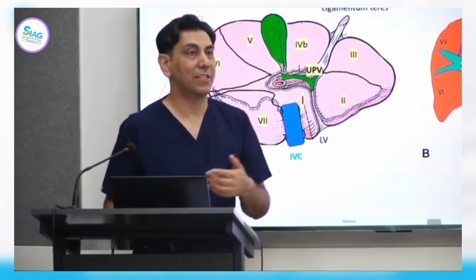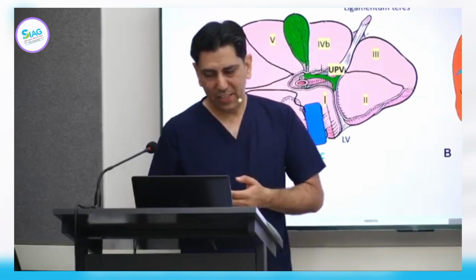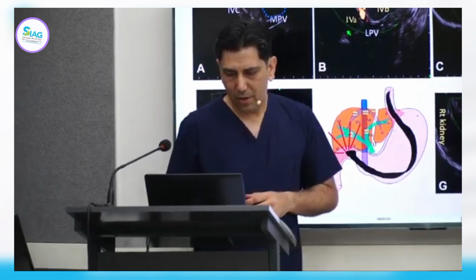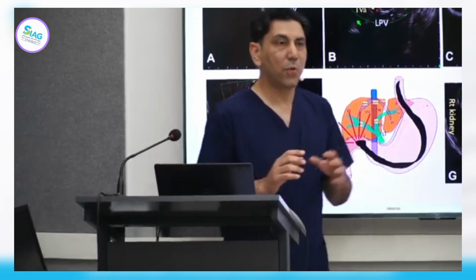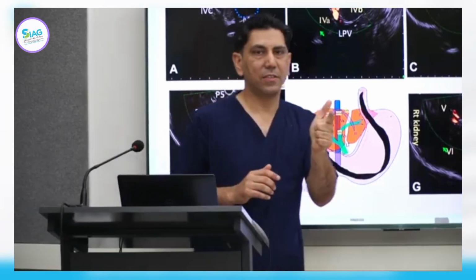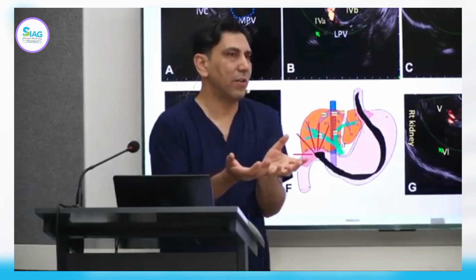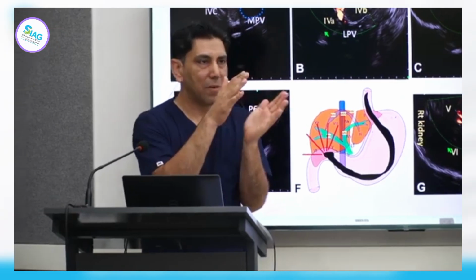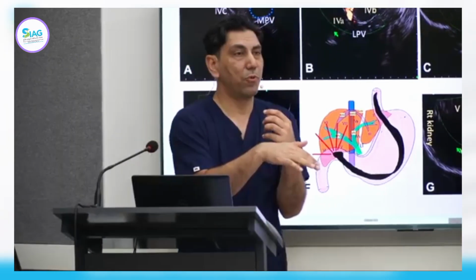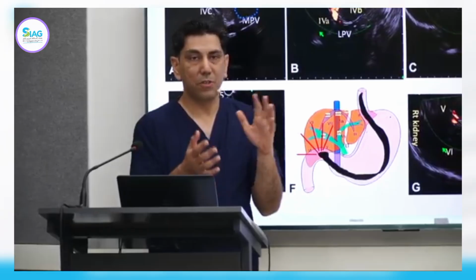This is again similar to the examination of D2 when you're looking at the uncinate process. In some cases, this is almost as difficult, because what we then have to do is identify one of those three structures in the duodenal cap: portal vein, CBD, PD. The portal vein is usually easy to identify, because the CBD in some cases may be of normal caliber, so it may not be seen, or with the pressure of the probe it's compressed and you can't see it.